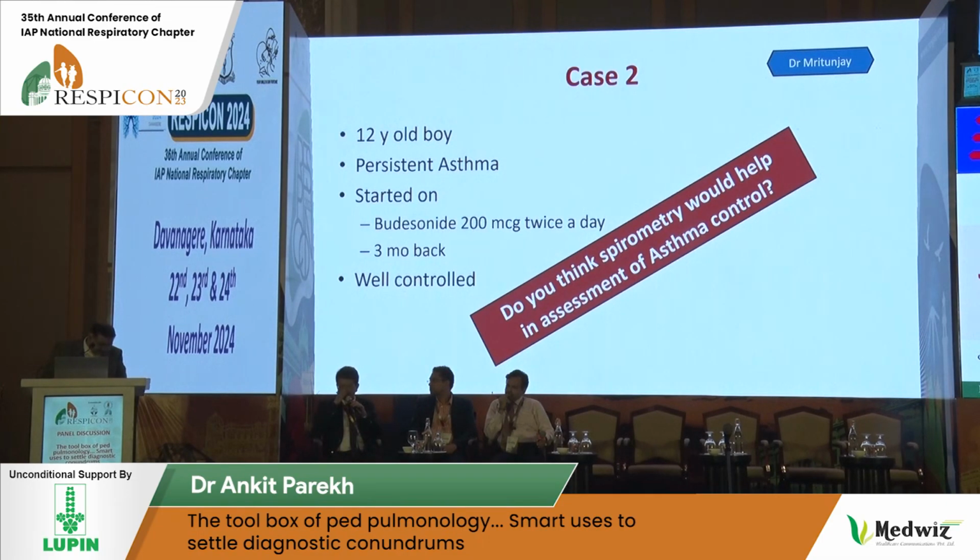There are many studies that say that although we clinically classify the patient as controlled or mild asthma, we often see that after we do the spirometry, the patient has a more severe form. So even though we think that clinically it's under control, it would be a good time to get a spirometry done to objectively assess the control or state of the airway.